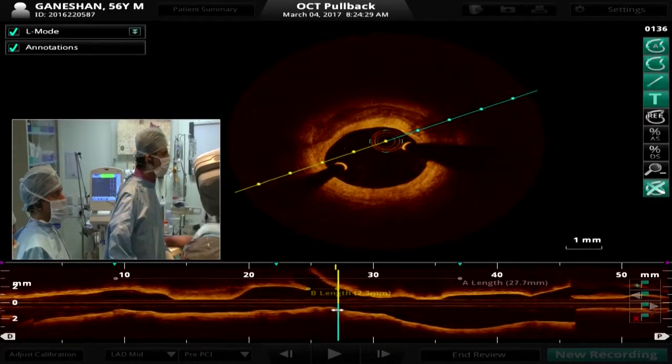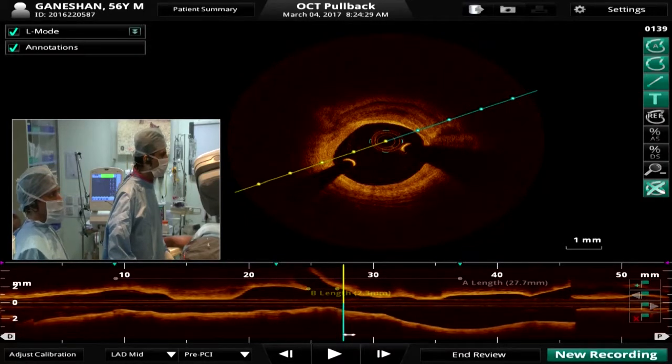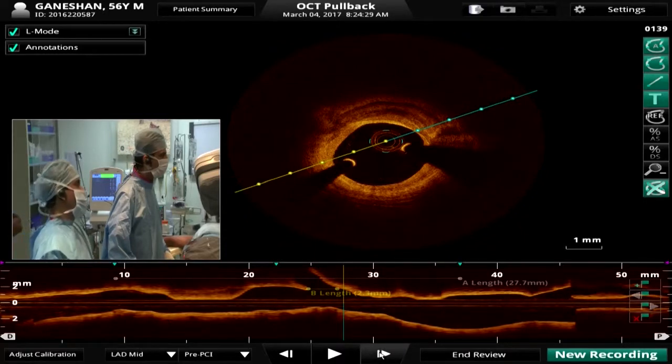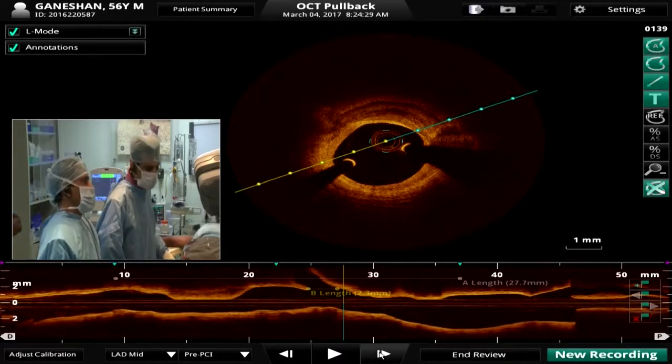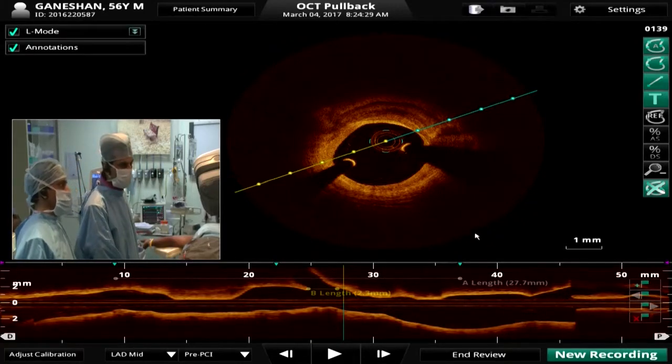I think we all agree here on provisional stenting, particularly now that we've seen that the ostium of the diagonal is safe. But I was mentioning two stents in the LAD, two separate ones to avoid the mismatch. One for the distal one and the one for the... That's an excellent question.